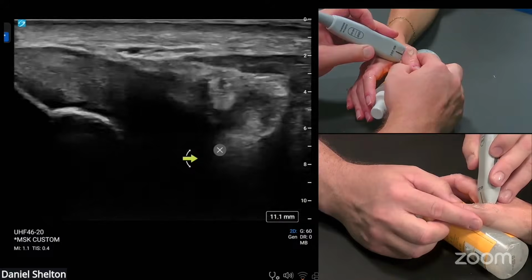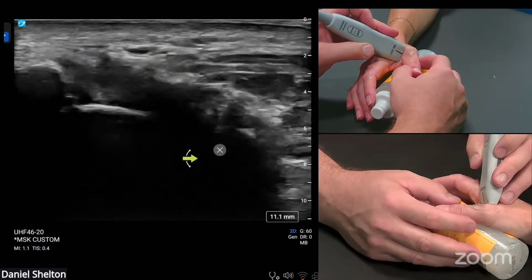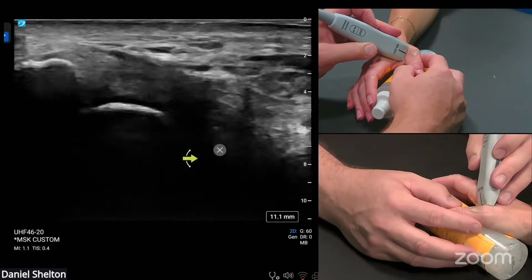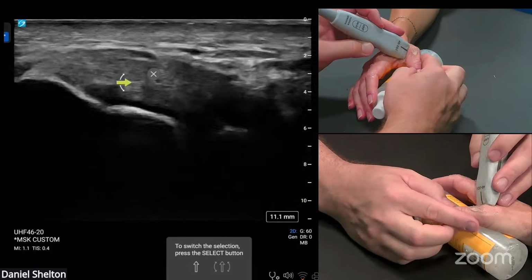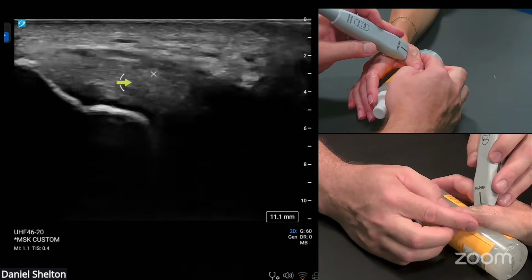And then that sesamoid gets encapsulated basically by the same ligamentous structures. And on the other side too, we have an ulnar sesamoid. But that would be the accessory collateral of the thumb. And then we would windshield wiper the other side of the probe over to the primary collateral to do that assessment.